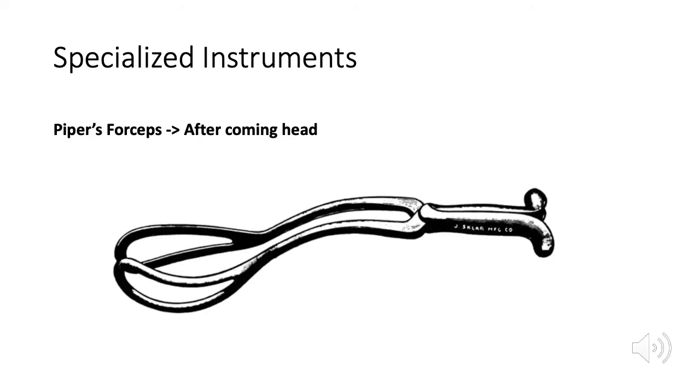Piper forceps were developed in 1925, and they're specifically designed to facilitate delivery of the aftercoming fetal head in breech vaginal deliveries. The dropped handles allow direct application over the baby's head without the necessity of elevating the body above the horizon. The backwards bends also give added traction, and there's no pelvic curve, which allows direct application to a high head.